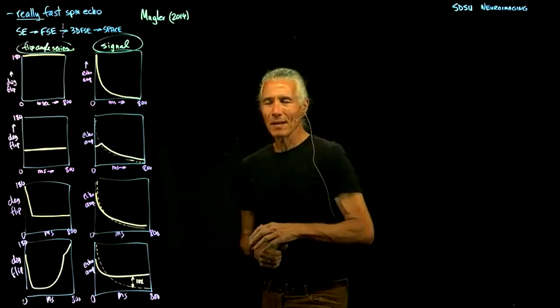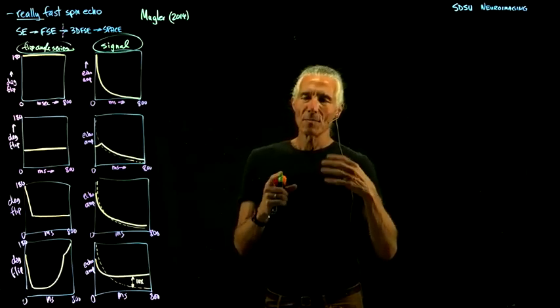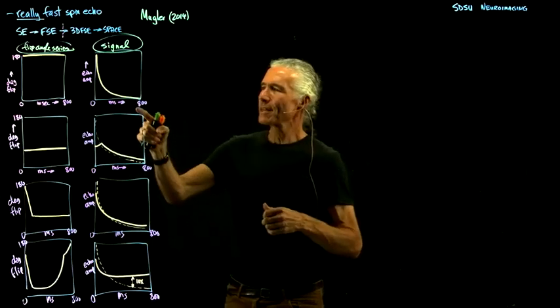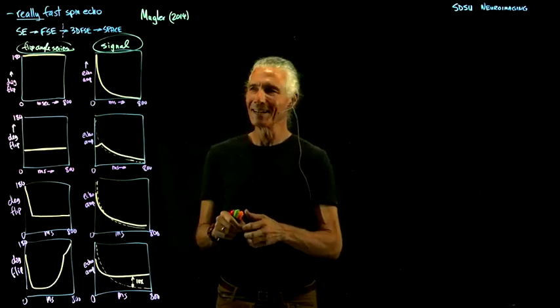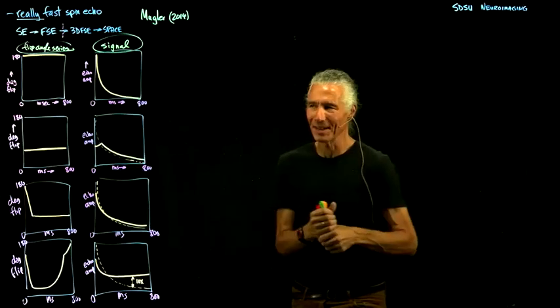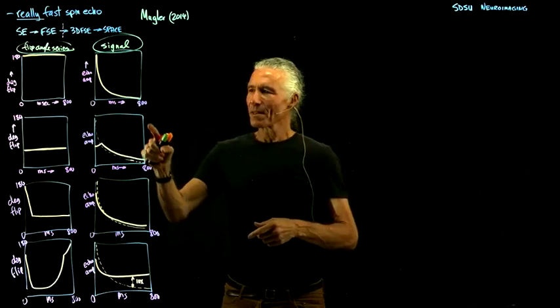And so what happened, the Human Connectome Project was a big scanning project to do a bunch of standardized data that multiple different research groups could work with. They looked at this and said, wow, you could use it in the brain. But amazingly, if you went to the Siemens scanner, it was under the abdomen. So you've got to look around, you don't just concentrate on the brain, look around all the other protocols.